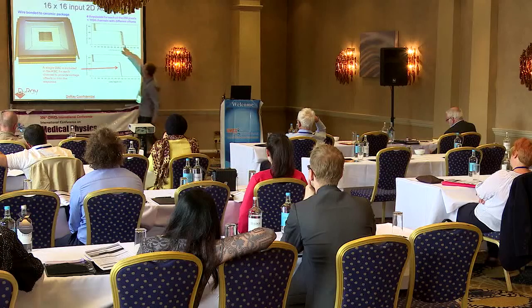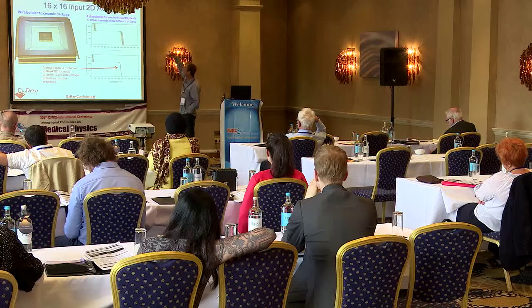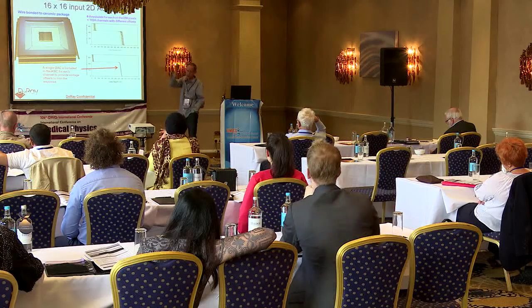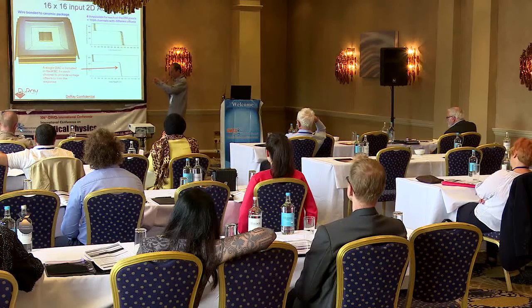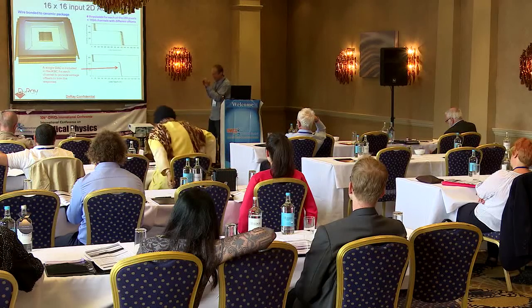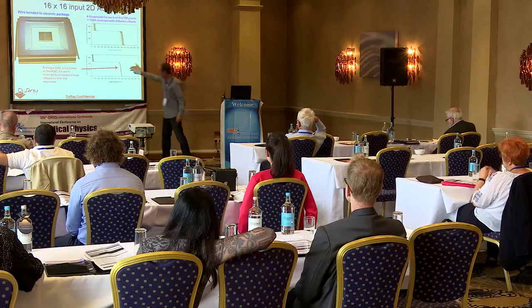And so here you can see the pulsar response. This would be integrated spectra. So differentiating this step function produces the delta function-like response that you would expect from a pulsar input. And so by adjusting the offset, by adding a small voltage with a trim DAC, a digital to analog converter, inside the ASIC on each channel, we can program the amount of offset that has to be added to each channel so that we get the same energy response.